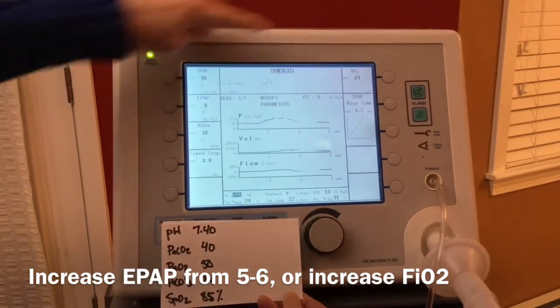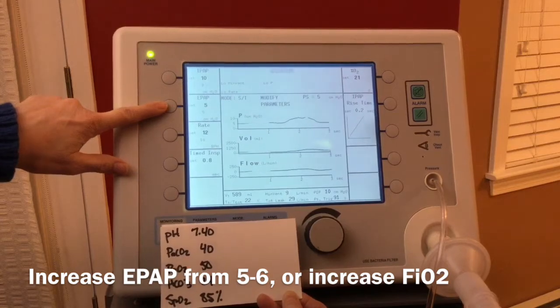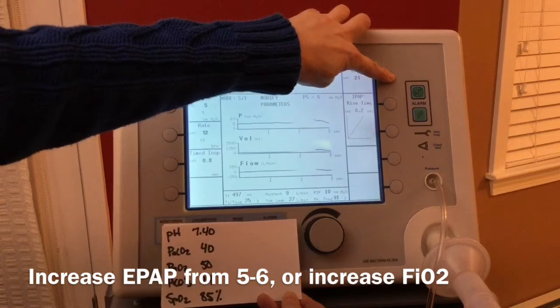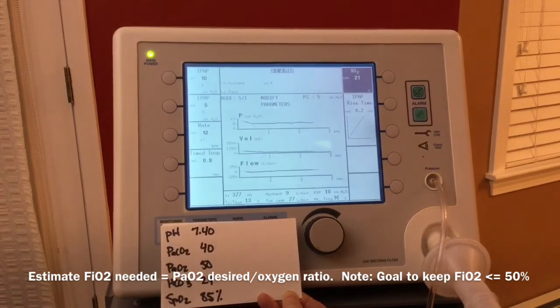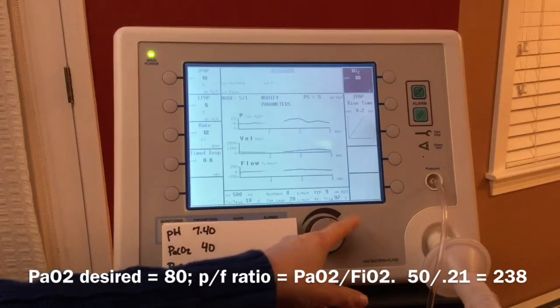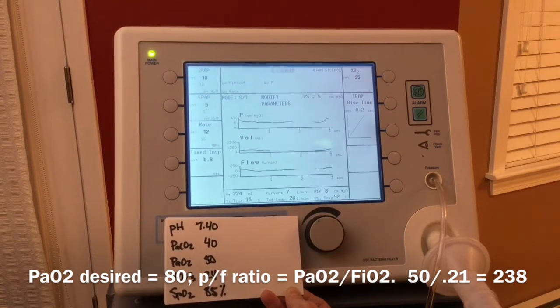But since my patient is only on room air and I'm on 10/5, the first move I would actually make would be to increase the FiO2 and supplement that patient with some oxygen. And what is the maximum amount of oxygen that we want to try and stay under? You want to stay under 50%. So for this patient, you may find that you want to go to about 30%, 35% to achieve a normal PaO2.